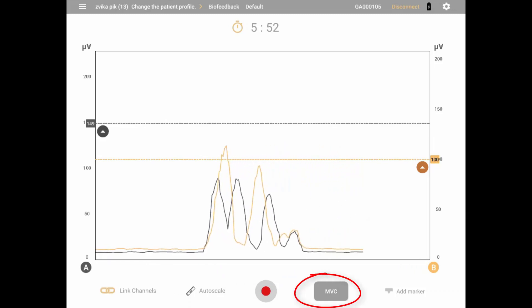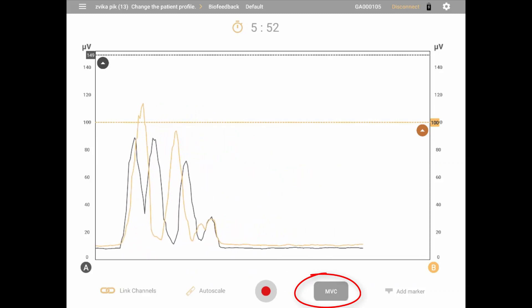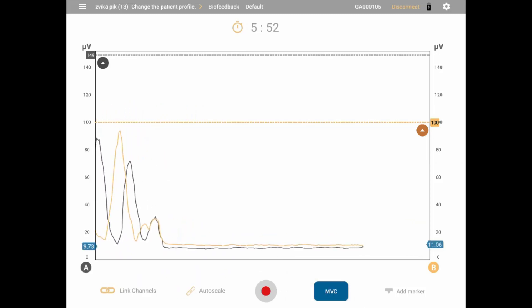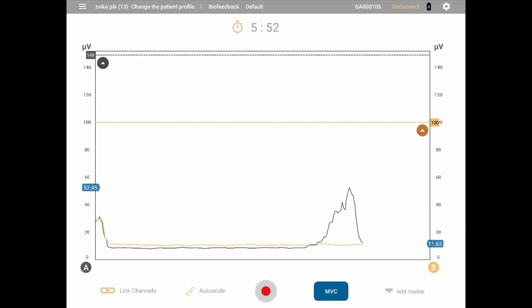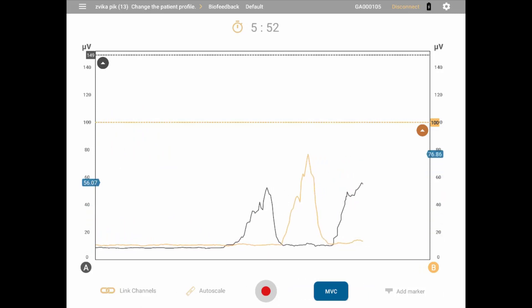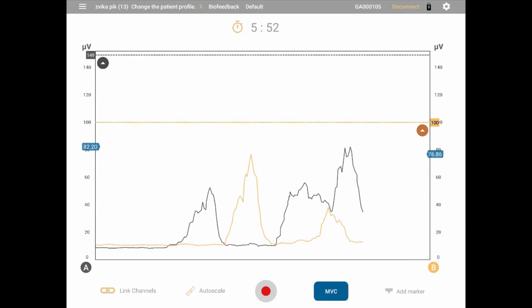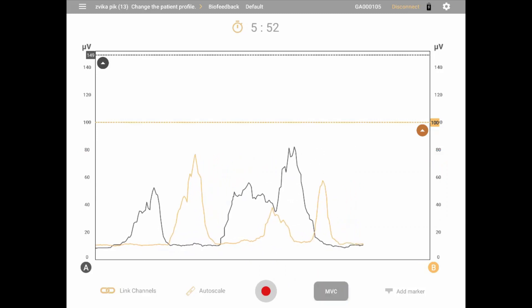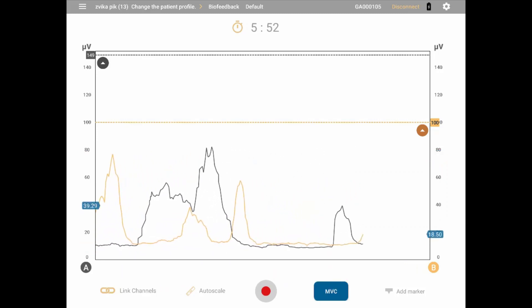Clicking the MVC button on the bottom right part of the screen will continuously display the maximum voluntary contraction reached by the patient for each signal on the corresponding scale. Turning MVC off and then on again will remove the previous achievement and start the calculation again.